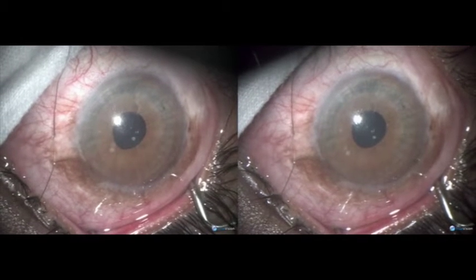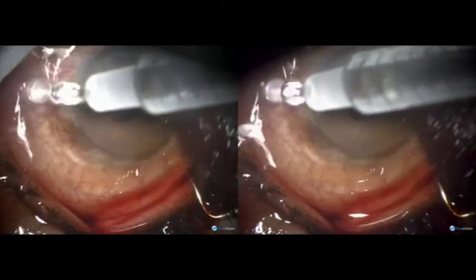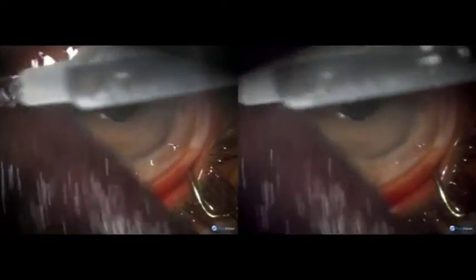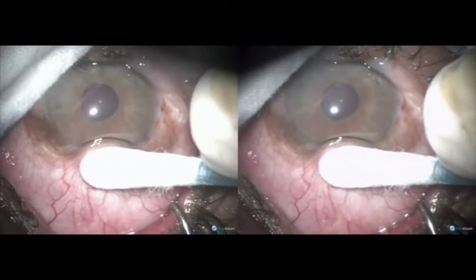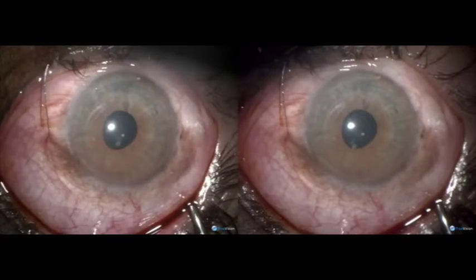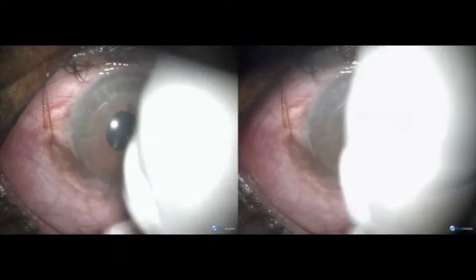Cleaning the conjunctiva with betadine and washing it thoroughly. The anterior chamber is deep. Checking the mobility of the conjunctiva. Cleaning the fornix.